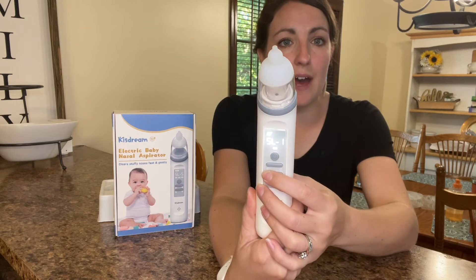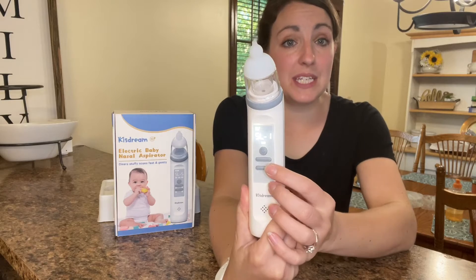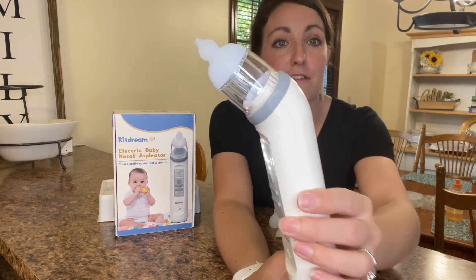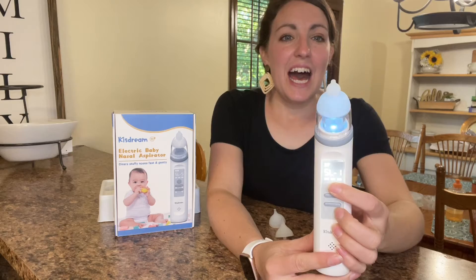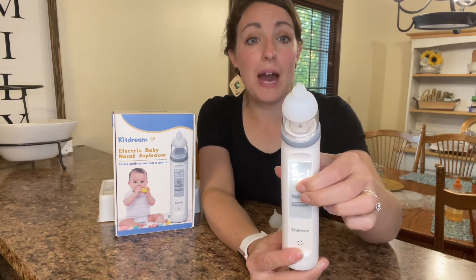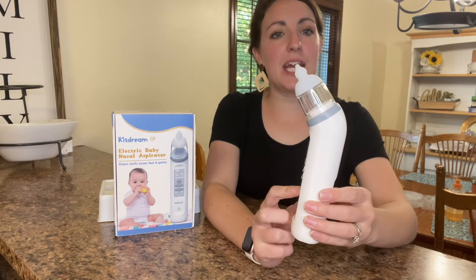You also have the pleasant fun music to keep baby's attention and the fun lights. I'm going to go ahead and show you guys how I use it with my little one, and you just hold down the power button again for it to power off.